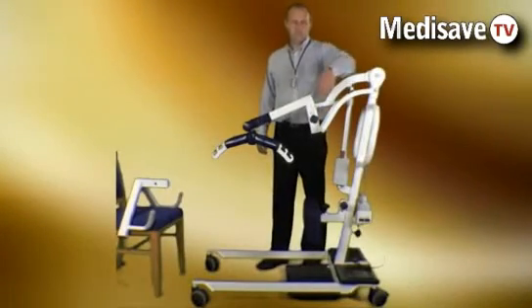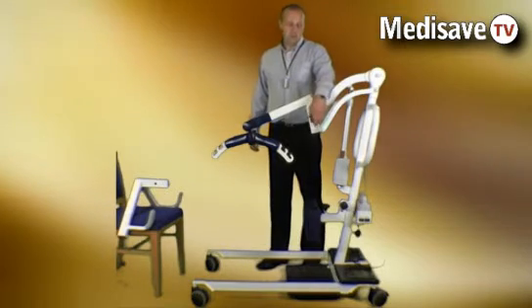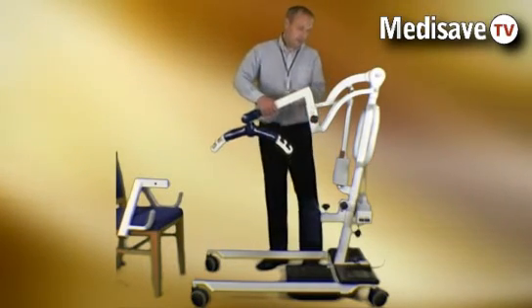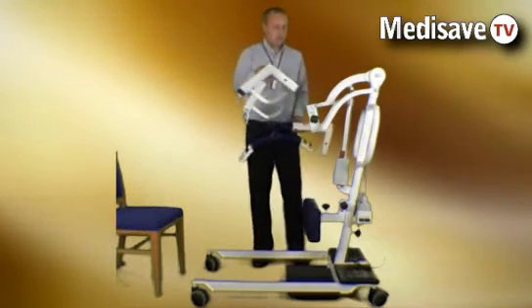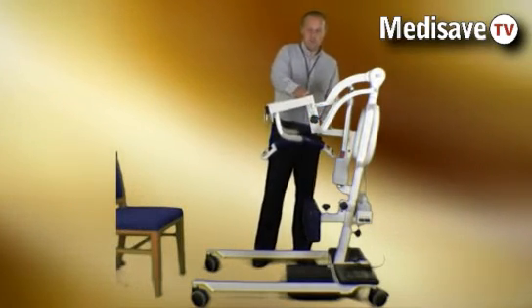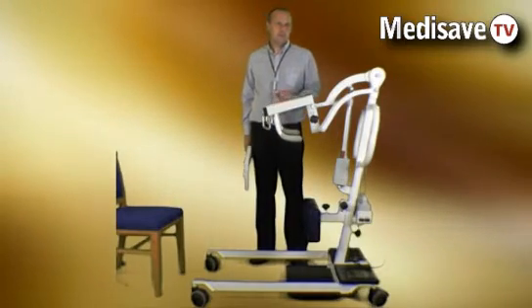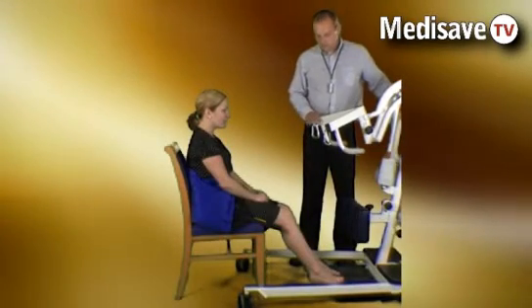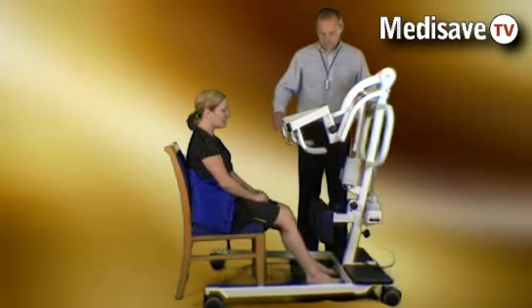The locomotor multi-lift hoist features a dual function where the spreader bar head can be removed and replaced with the stander head, giving two functions in one machine. In the stander function, the multi-lift is brought to the patient.